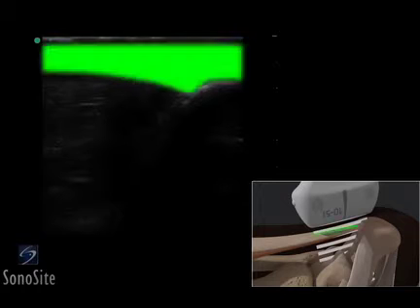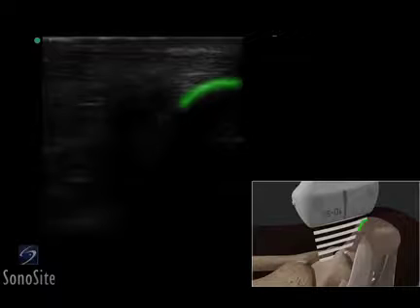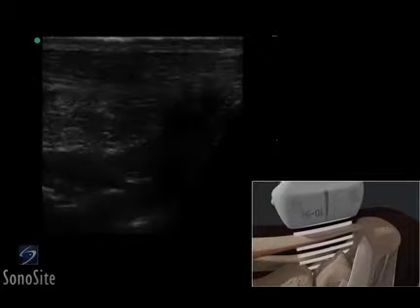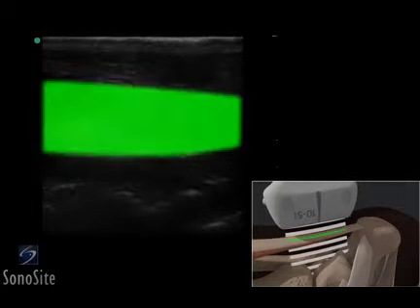The Achilles tendon has a compact fibrillar pattern extending to the insertion on the bright, hyperechoic calcaneus. The tendon should be scanned proximally to identify the unorganized signal of Kager's fat pad, deep to the Achilles tendon, continuing until the striated pinnate pattern of the soleus muscle is seen.